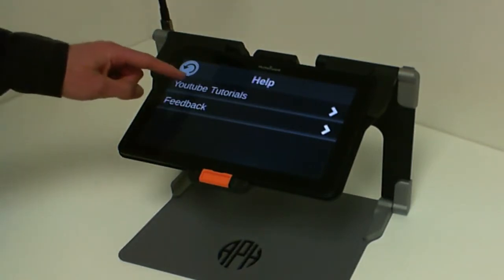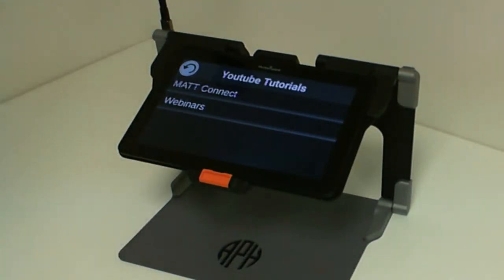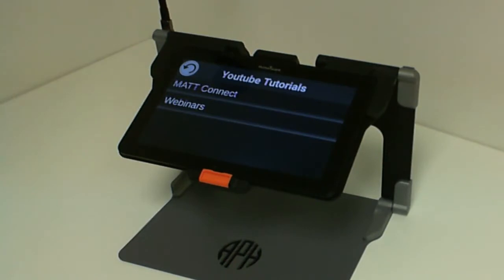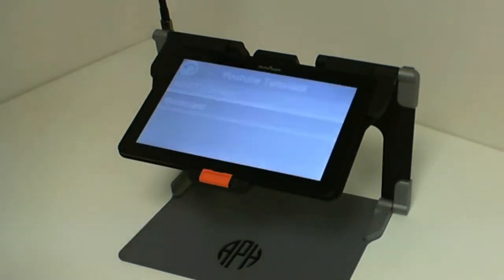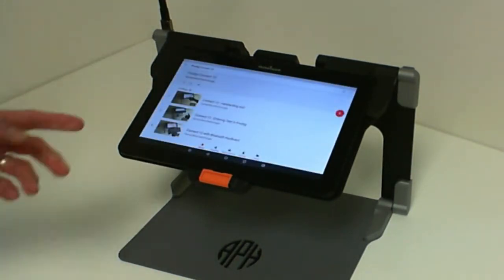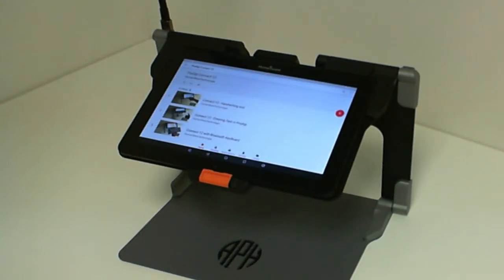If you select YouTube tutorials, you will be brought into two types of YouTube tutorials: one for the MatConnect and the other ones are all the webinars that have been done for the Prodigy software. If you select one of them, you will be brought to the YouTube application to that playlist.